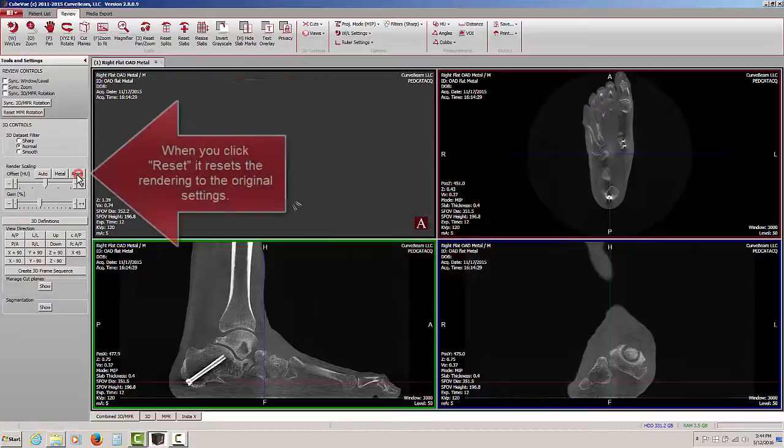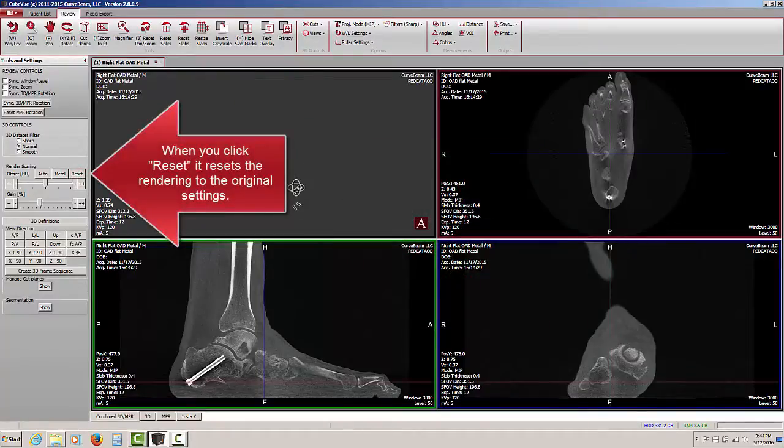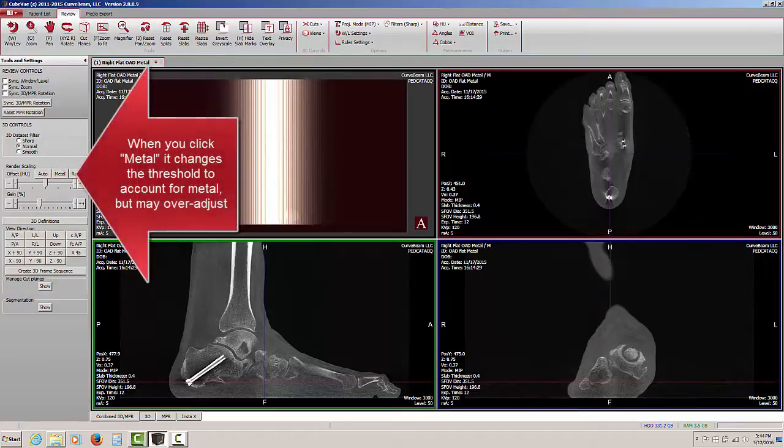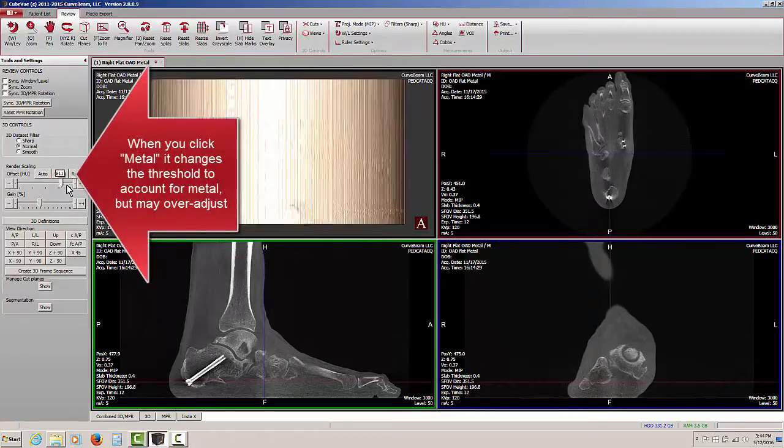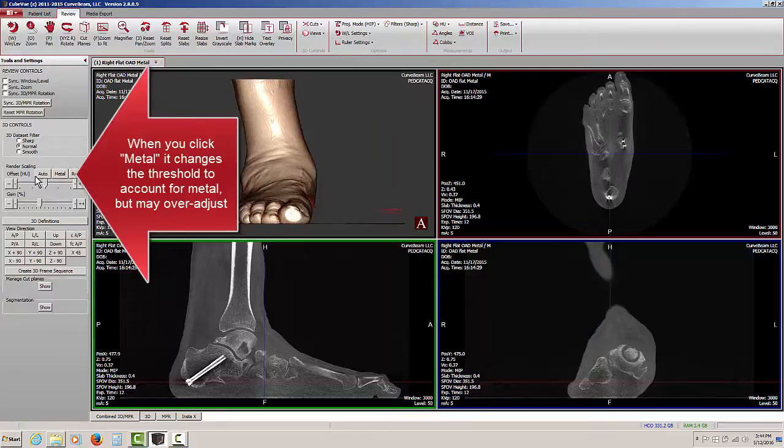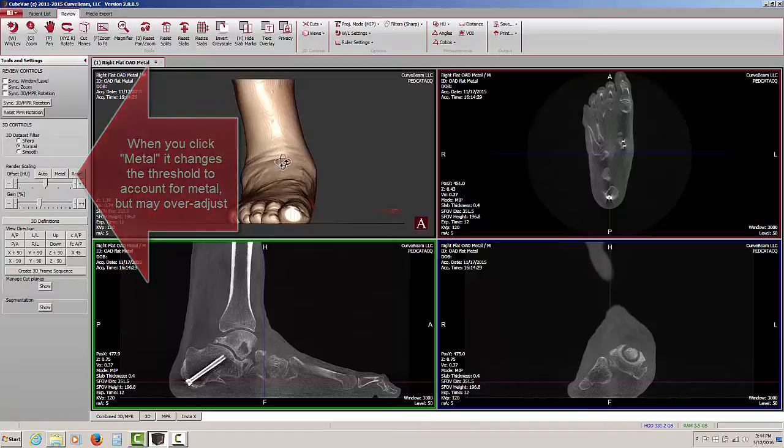Hitting reset will take us back to the original view that we had. Hitting the metal button may overcompensate and then you would have to remove some of the data by sliding to the right and removing some of the softer tissue or noise.